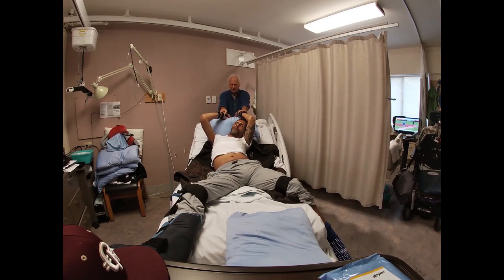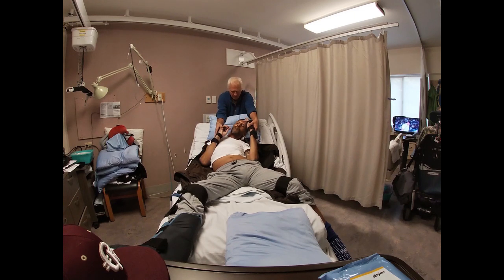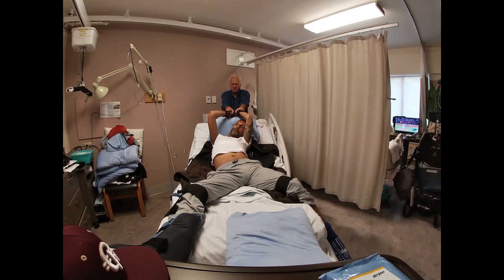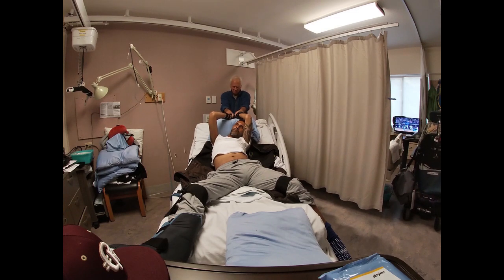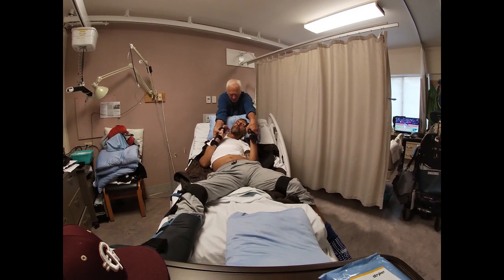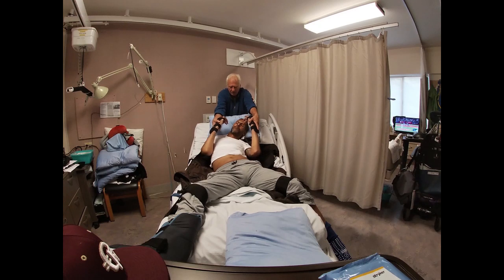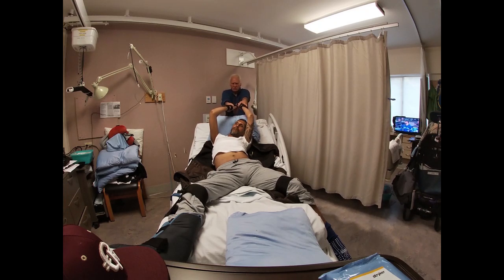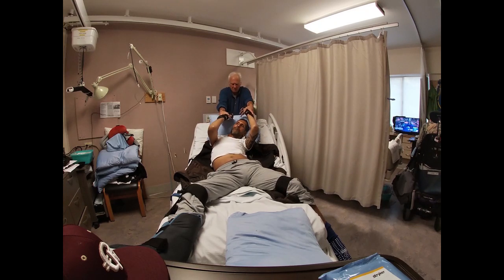Okay. Going back down again. That's it, resting. And let's do another stretch up. Okay, in your mind, stretch them up. So here we got his hands at the top of the bed. Come back down again. And again, up. And down.